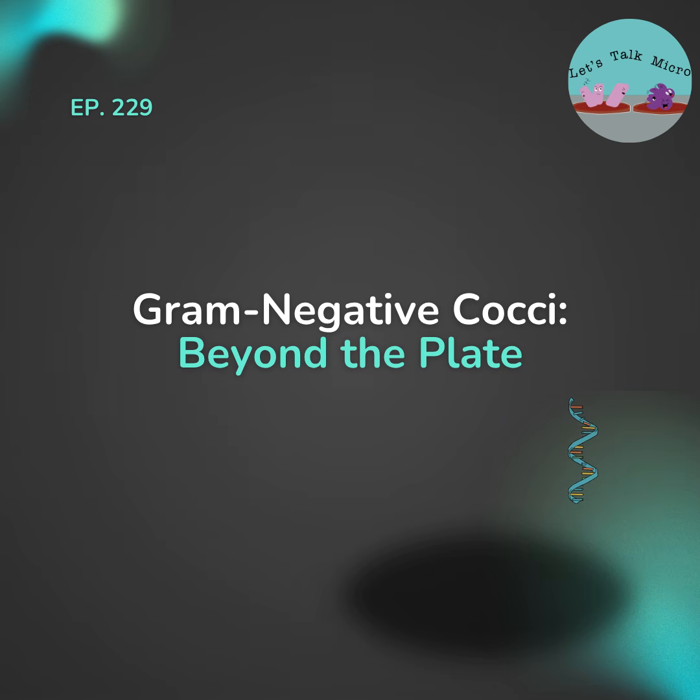Okay, so by now we have discussed how to identify them once you have grown them in the lab, right? You went through putting it on media, you grew it, you isolated it, you identified it, and you're good. How about from direct samples? Well, if you work in the microlab, you know that a lot of testing for Neisseria gonorrhoeae is done via molecular methods. Neisseria meningitidis, as we have discussed, is an organism that is seen in meningitis, which is very critical. So if you have a meningitis panel in the lab, like a PCR panel, it makes sense to have Neisseria meningitidis in this panel. And I will talk about this in a few minutes.